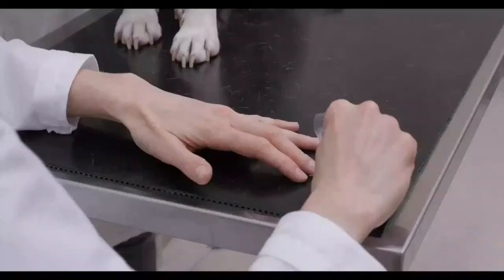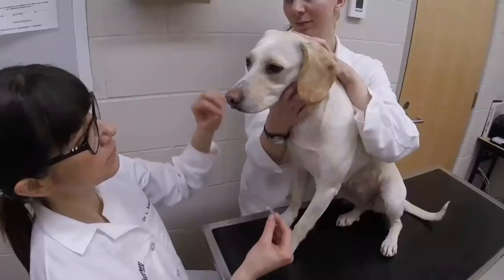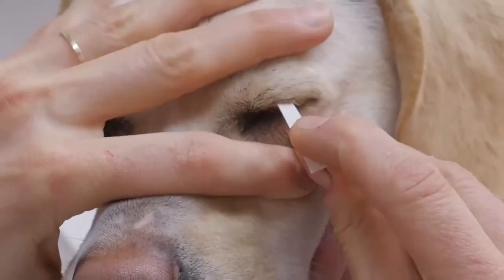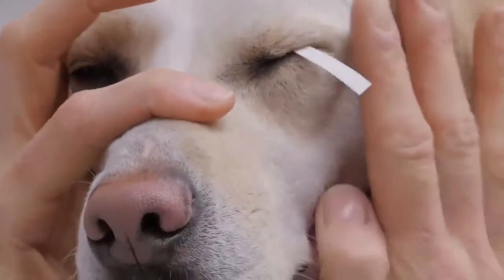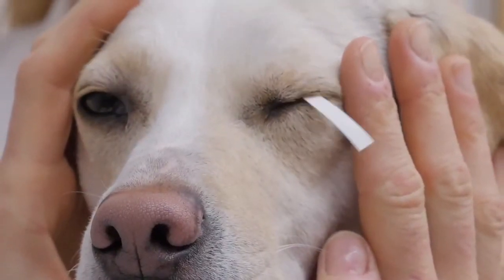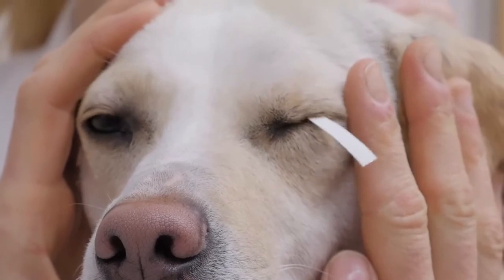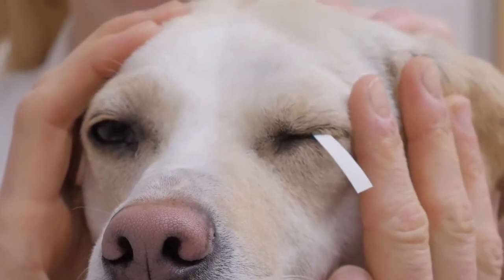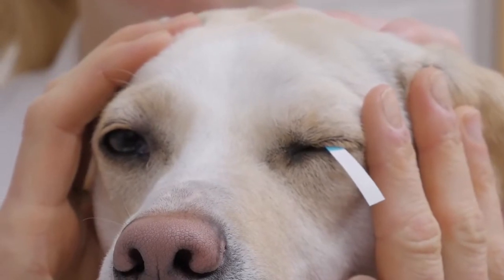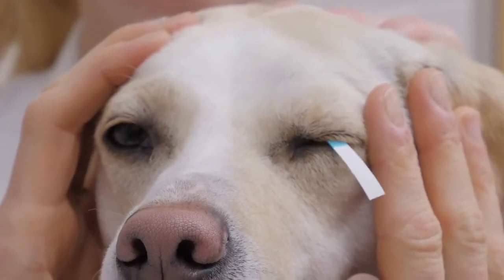The strips are then removed from the packaging, grasping the strip from the end opposite the notch, and the folded end of the strip is then hooked over the eyelid and placed in the ventrolateral conjunctival fornix of the eye. Strips are left in place for a total of 60 seconds. If blinking or retention of the strip during the test becomes a problem, the lids may be closed gently for the duration of the test.